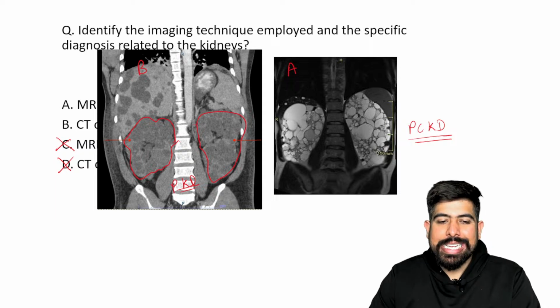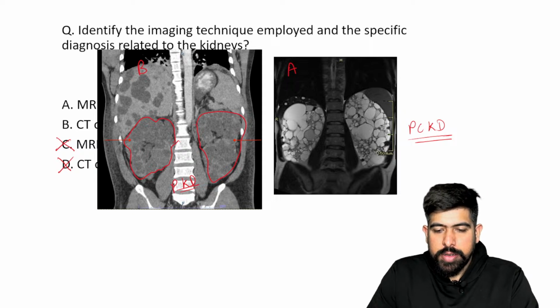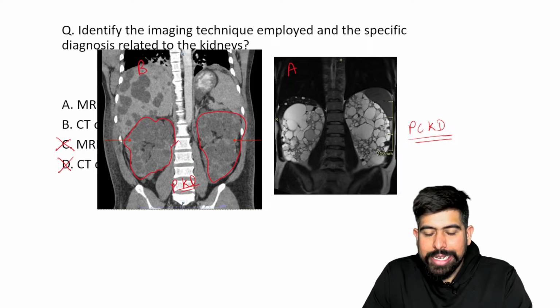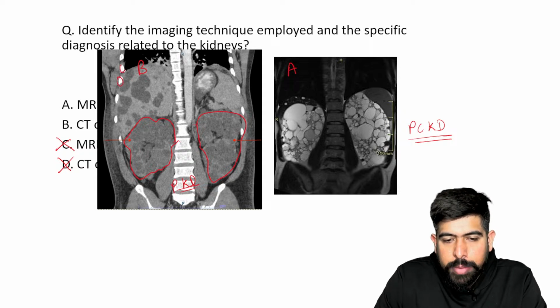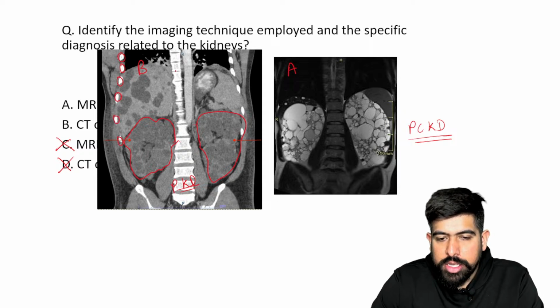Just let me know, in the CT scan which rays are we using? Please reply to my question. CT is just a multi-axial X-ray. Very good. And now tell me, on the X-ray, the bone is seen white, yes or no? We saw many X-rays here of the chest, thorax cavity. You can see these are the bones, this is the vertebra, the vertebral column is there. These are the ribs. Can you see these ribs are seen white?